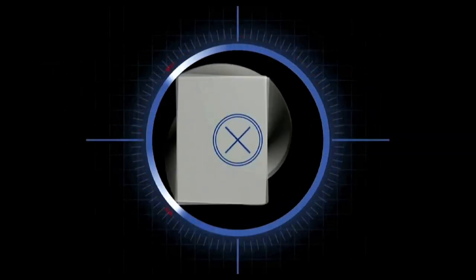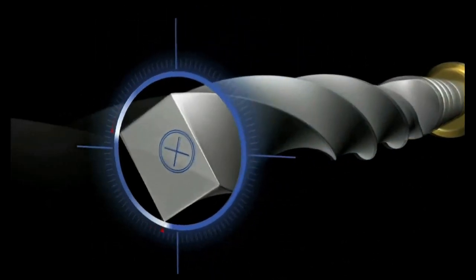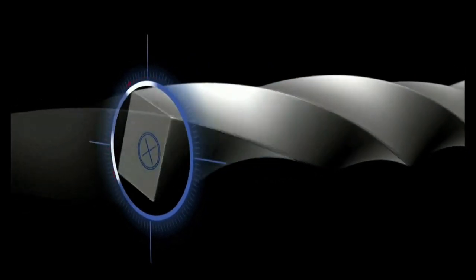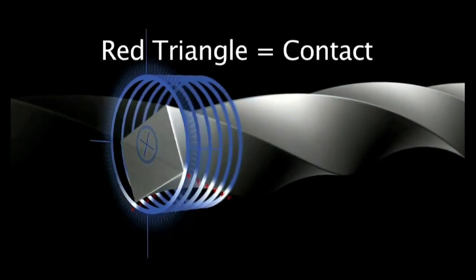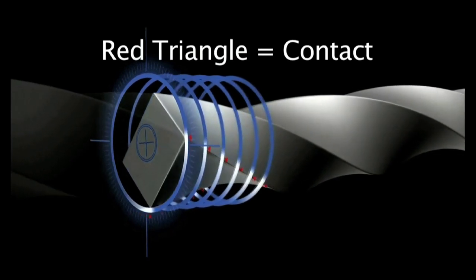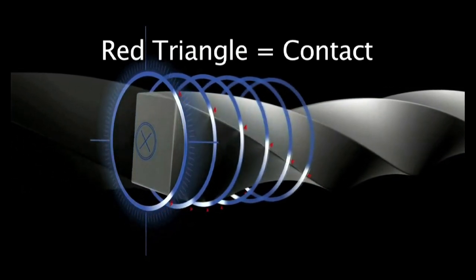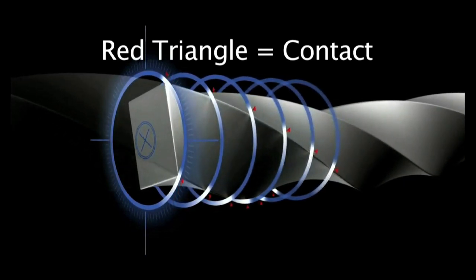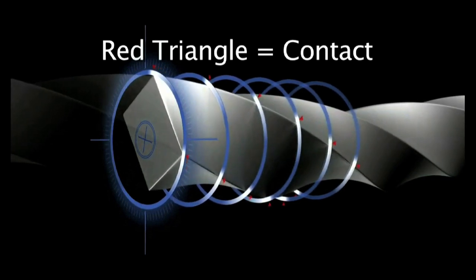You'll be able to begin to sense where the 2 points are cutting, and there's only 2, and as the instrument rotates, of course, those 2 points of contact continue to cut along the blade where the red arrows are. But where there are no red arrows, there's no contact. If we slow this down, you might be able to see it easier. It's just the points of the red arrow.